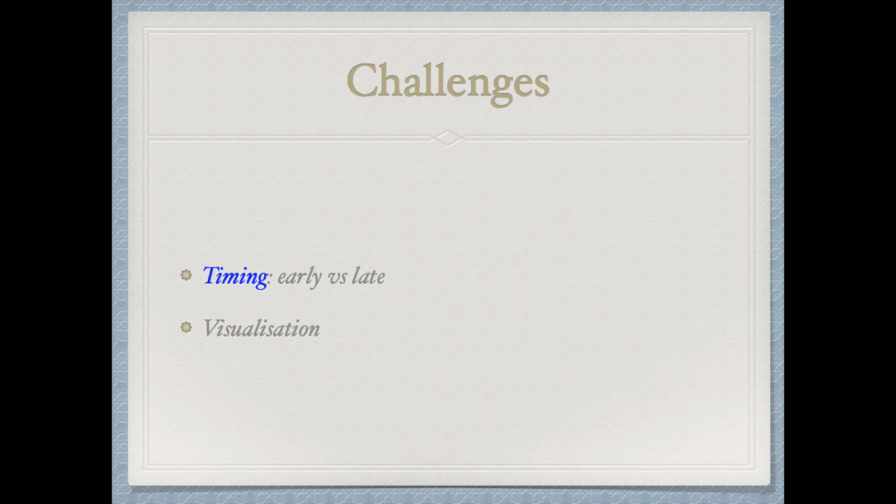Trauma has many challenges. The first of them is what is the proper time for intervention. Early intervention is beneficial in managing complications like retinal detachment and intraocular foreign bodies. But early surgery is often accompanied by a high incidence of PVR.